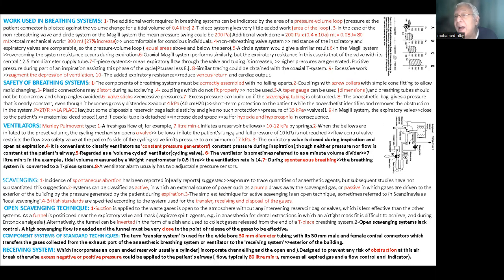You can see the line that considers the separation between inspiration and expiration. We call it 0, so this is the zero. We can see that the loop is being shifted upwards, and this one is much more shifted upwards. So this is the difference between the four systems we had mentioned before regarding the resistance of breathing.